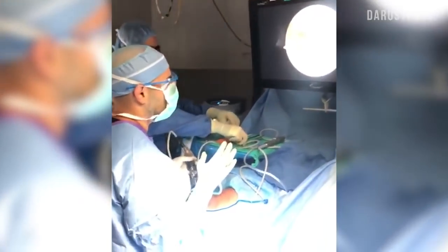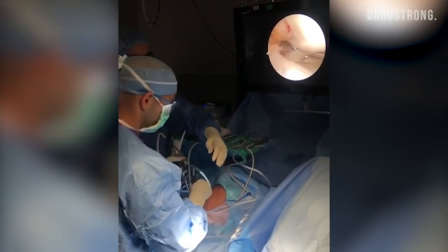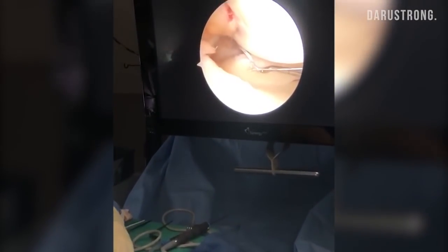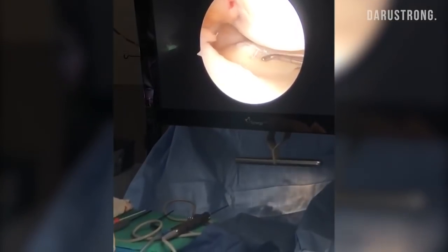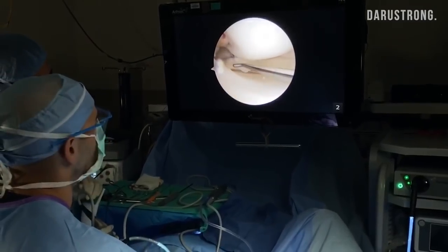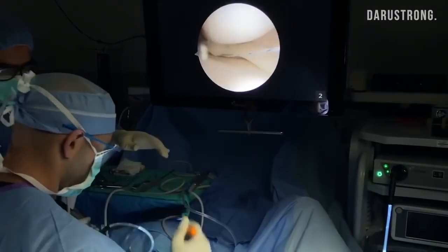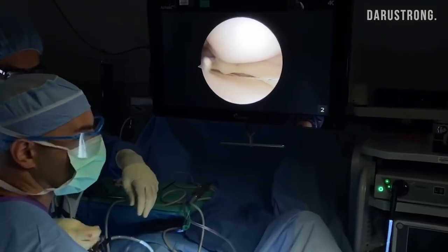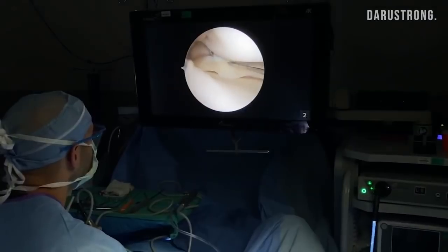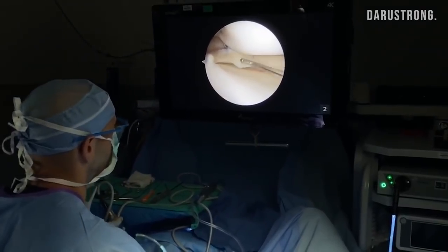I'm going to pull the meniscus into a reduced position. Here's my probe — I introduced it at the medial portal. Holding this meniscus down tight while he's going to pull tension on it. You remember where our tear was — go ahead and pull that for me. He's pulling it real slow, and I'm holding the meniscus in place where it needs to be. That suture should go right across that tear. Look what that just did — that's what we want to see. We've got two sutures here across the tear. For a guy like Phil I'm very aggressive — I want a really strong repair. We want to make everything the best possible. We're going to put one more suture right here because I don't want to second-guess this repair at all.